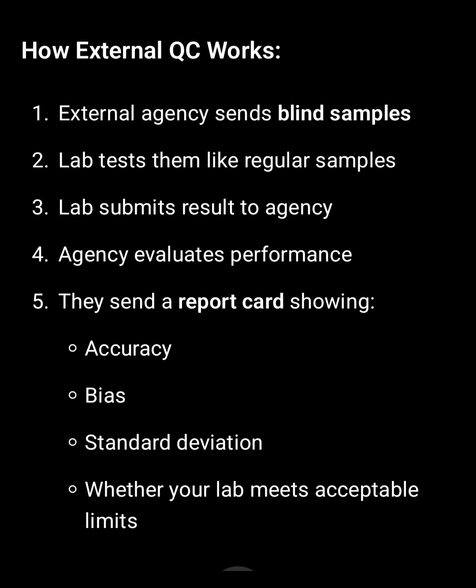How does external QC work? External agencies send blind samples. The lab tests them like regular samples. The lab submits results to the agency. The agency evaluates performance. They send a report card showing accuracy, bias and standard deviation, and whether your lab meets acceptable limits.